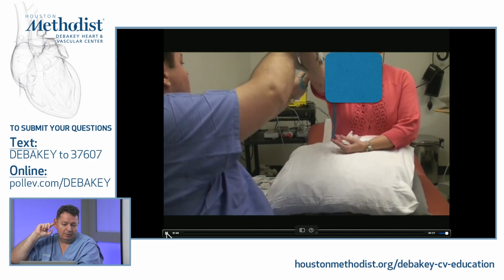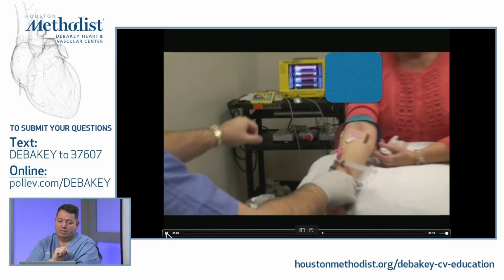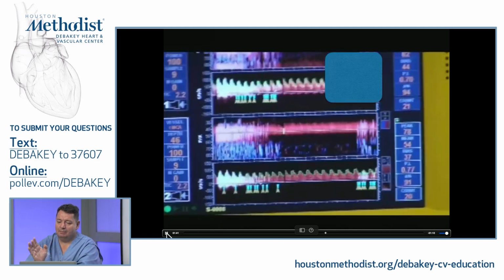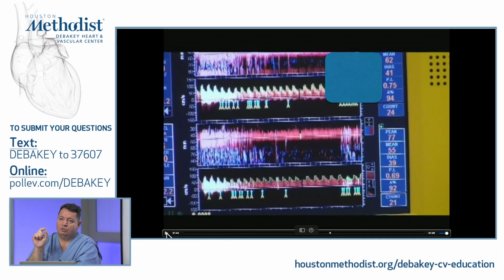Blue, blue, blue, blue, blue. In the background, you guys already hear the bubbles, and you see it on the screen. So this was less than 3 seconds. You had bubbles in, and we haven't done Valsalva. The reason I didn't do Valsalva is because I wanted to give the bubbles a chance to go to the right atrium. If you do the Valsalva and you inject during Valsalva, that would prevent your venous return. So that's why I am waiting about 3-4 seconds.